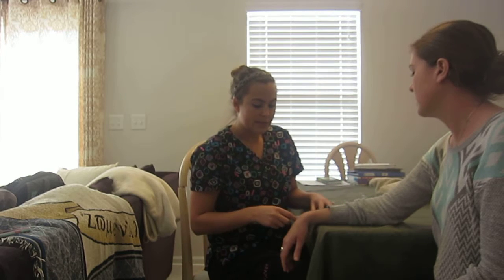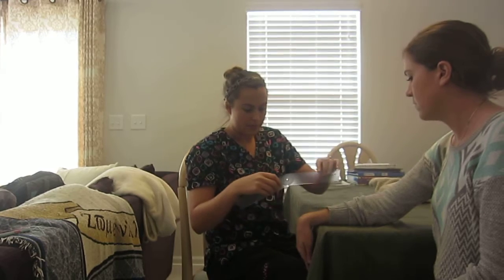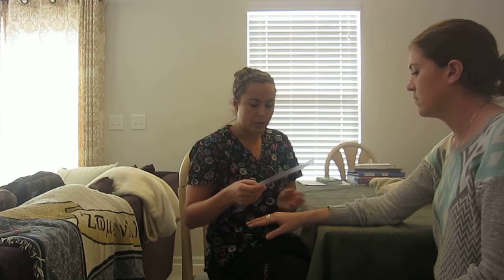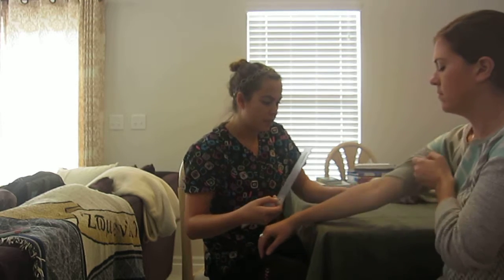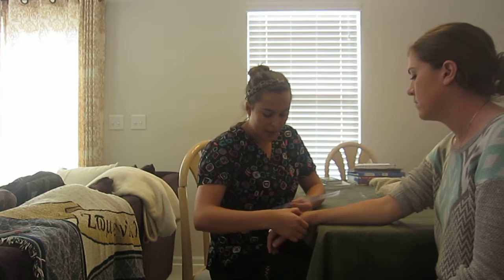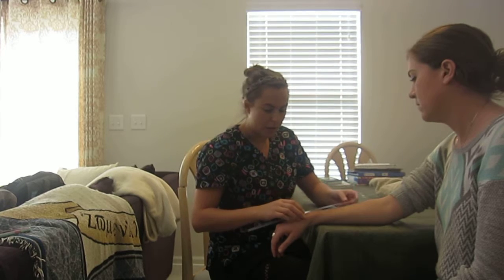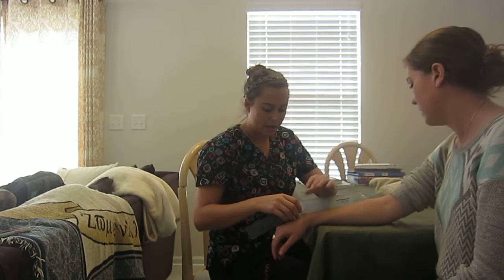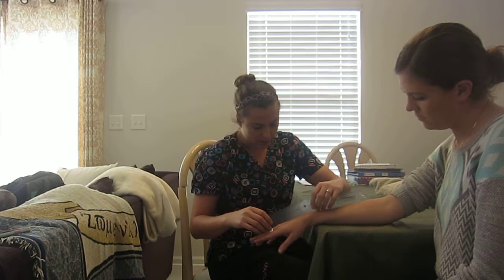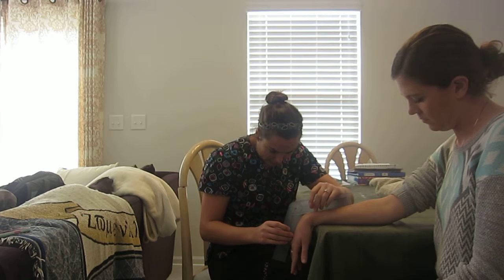So the first is wrist flexion, so I want you to bend your wrist as far as you can. Okay, and so what I'm going to do, I'm just going to raise it back up to show you our landmarks. So if you don't mind moving this up. So the fulcrum is going to be at your capitate, so right here. The stabilized arm towards your lateral epicondyle, and then your middle finger is where I'm going to be using the measurements, okay? So go ahead and flex as much as you can.